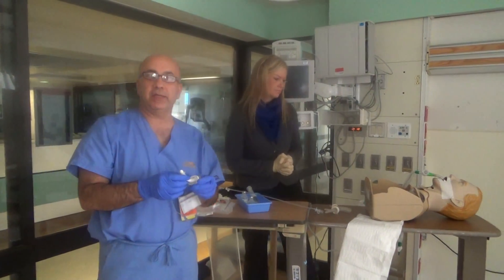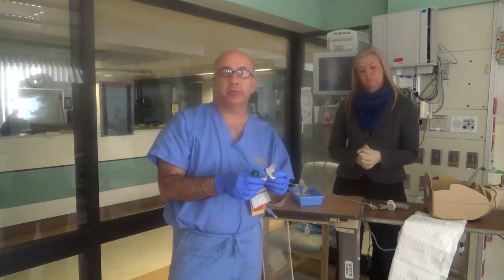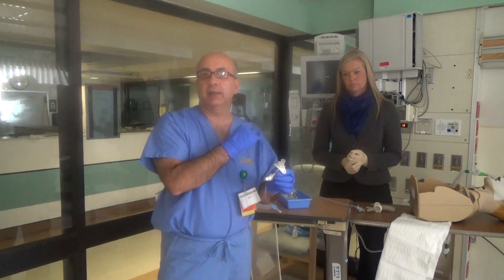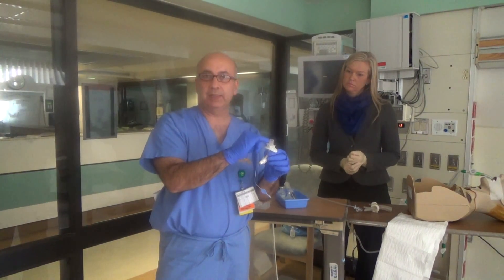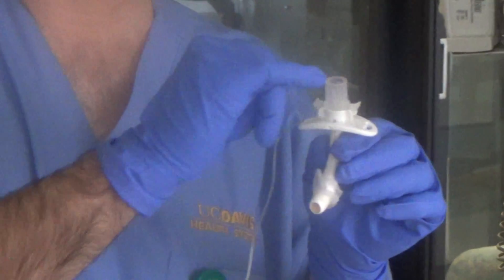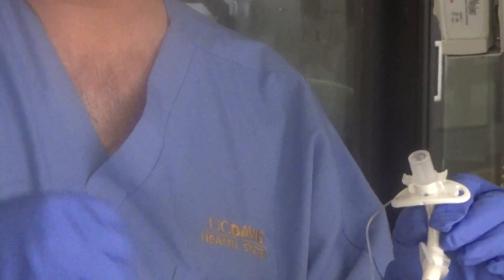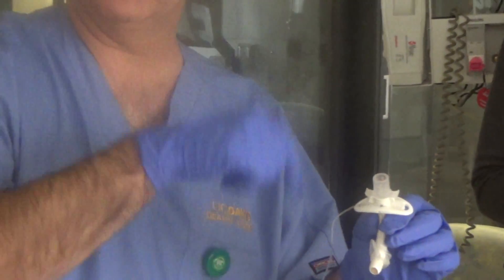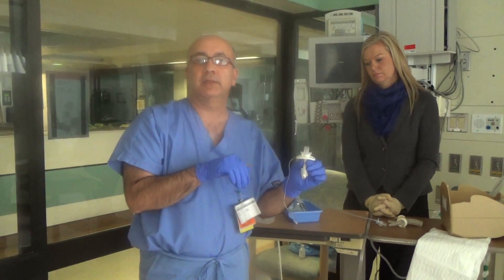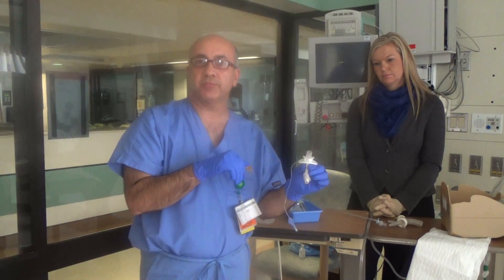If you have a patient with a tracheostomy and want to do the mini-BAL, it is also a blind procedure and requires much less sedation — it is a very quick procedure. You usually want the mini-BAL to be around 16 to 18 centimeters at the hub of your inner cannula. If a patient comes from a skilled nursing facility, take out the inner cannula which is dirty, discard it, and put a new one in, then perform the mini-BAL procedure. At 16 to 18 centimeters, you will be in the right lower lobe and able to retrieve the specimen. Thank you.